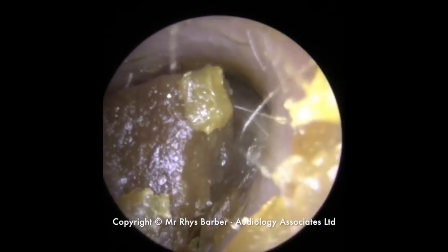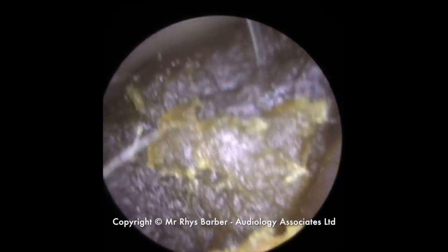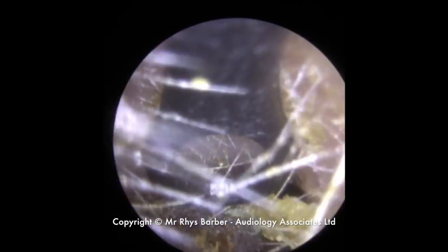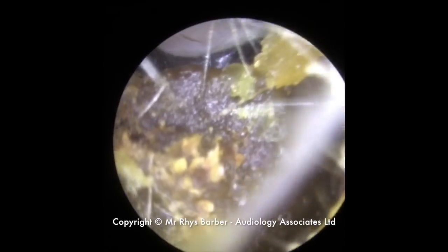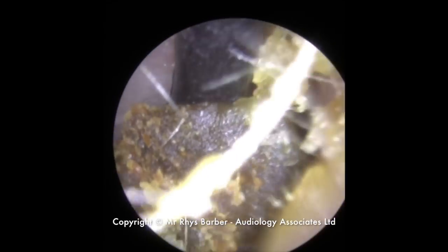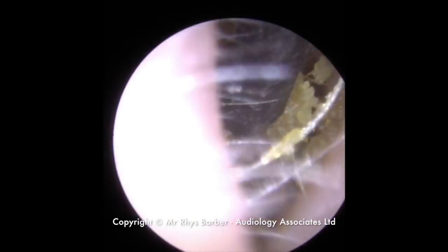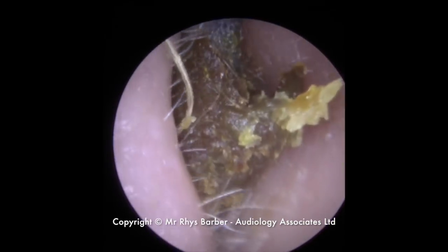We have an earwax extraction video for you, so you can see a large lump of what looks like quite sticky earwax. So I've opted to go in with a Jobson Horne here. It's a bit shaky when we start off, but we're just going over the top of the wax. You can see the slight bend in the Jobson Horne, so we're trying to get behind this initial section of wax to take this away.